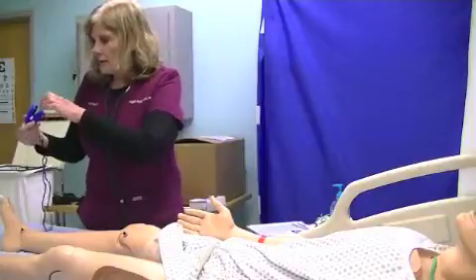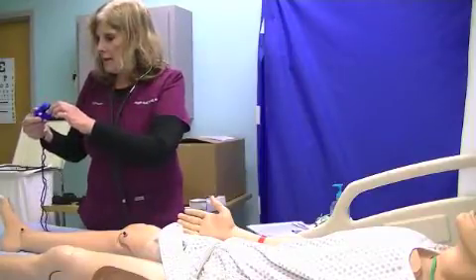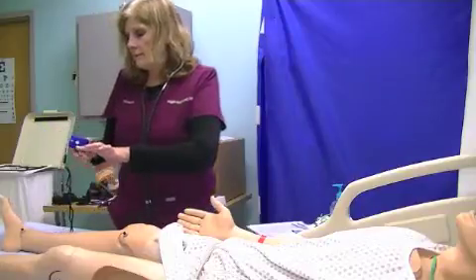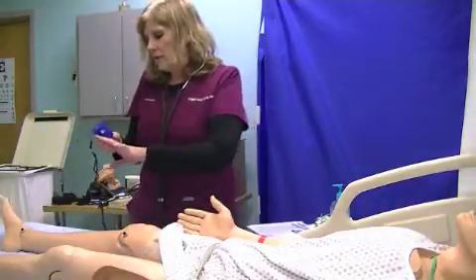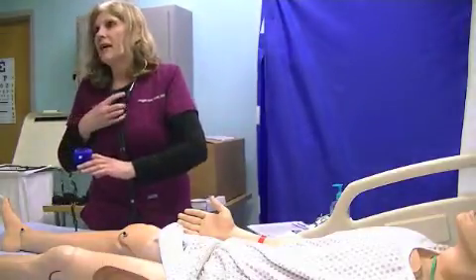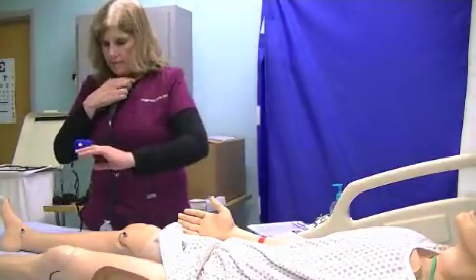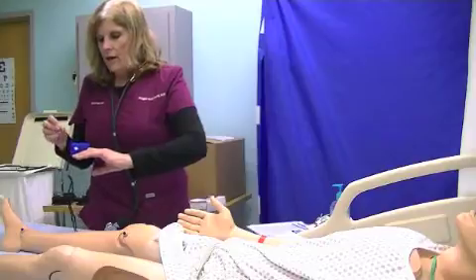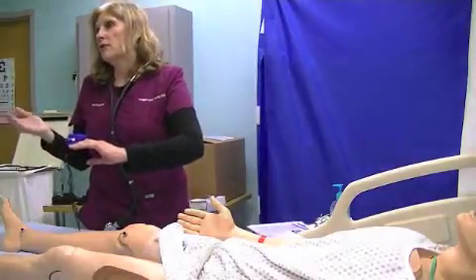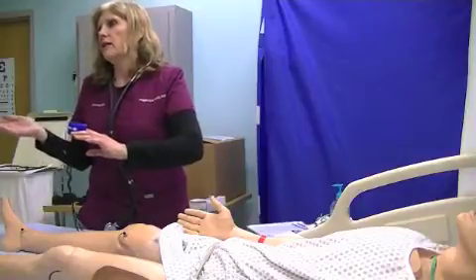That's where the diodes are, on the top and bottom, and they have to be lined up. You're going to put the finger in, push the button, and it takes just about a minute to read it. On this, it's going to have the saturation of oxygen in the blood. We're going to look at what the normal saturation should be for somebody that's younger, like 60 and below.